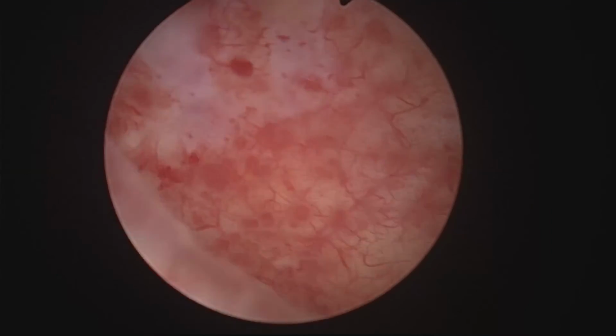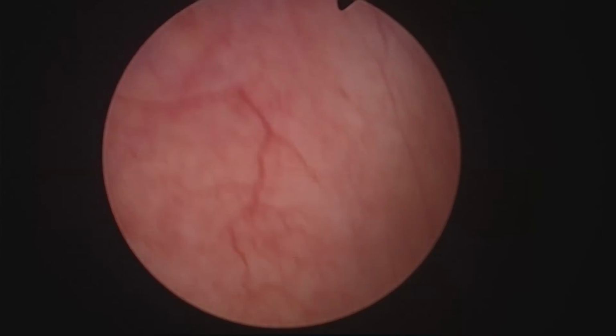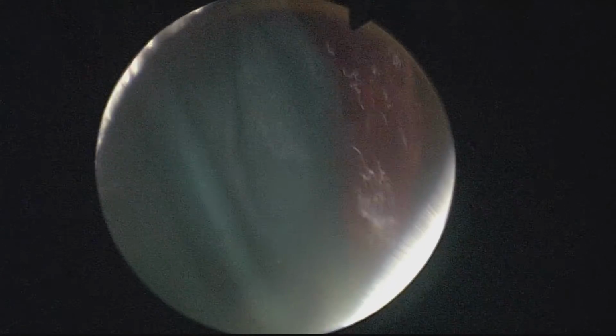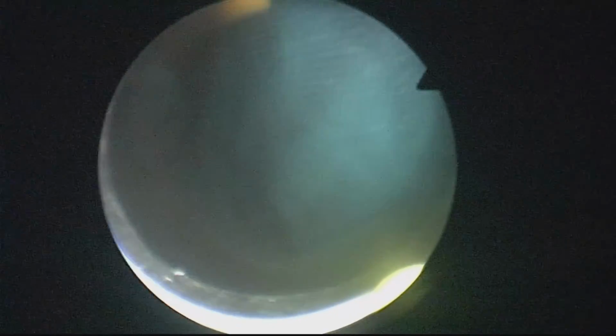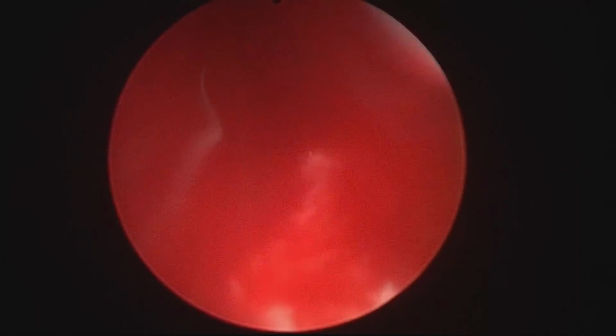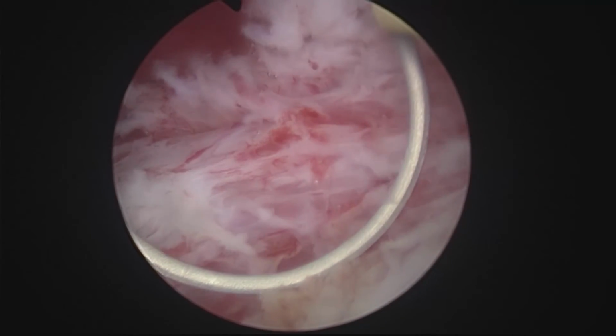And I thought this was the third sample. And as I said, we're going to change now for a resectoscope. See, there's a light hematuria. Usually, if you put a catheter, that completely stops, and it's not very relevant. But as I was going to go in with a monopolar resectoscope, I thought there's no need to be very, very thorough with the hemostasis, and we can finalize with the resectoscope.